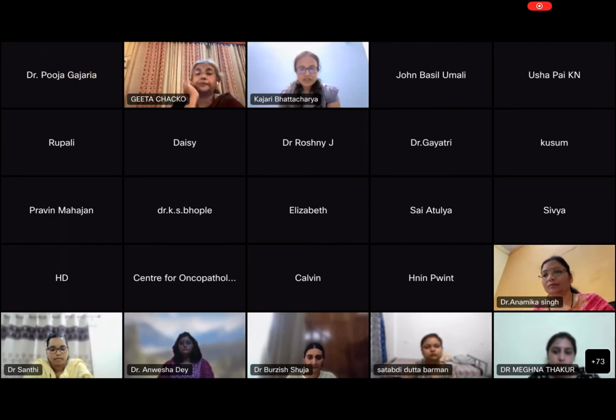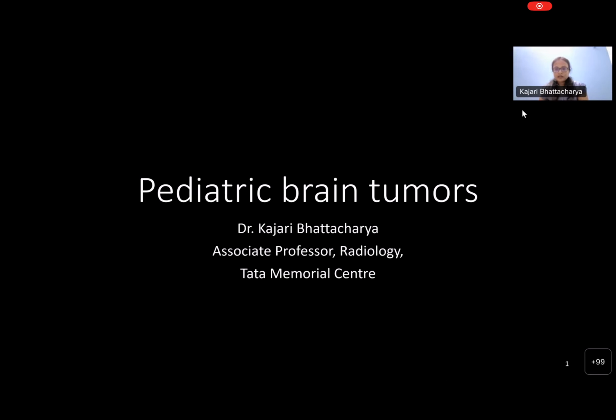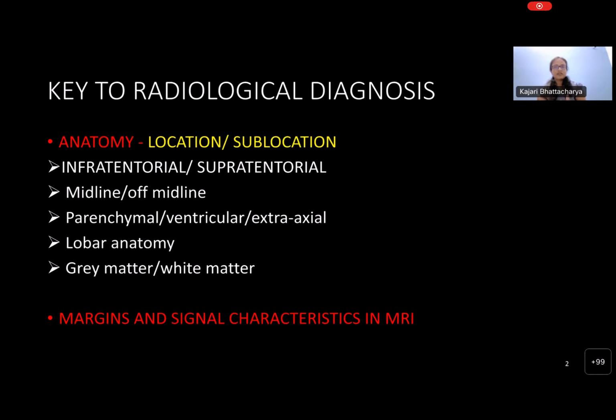Thank you so much, ma'am. So I'll just make a very short presentation to give a very basic idea to our pathology residents here of what we are looking for in an MRI. So I'll just go full screen. Yeah. So let me start. Whenever we are talking about pediatric brain tumors or any brain tumors per se, radiology is extremely important because radiology is a key to your diagnosis and your interpretation of pathology also.